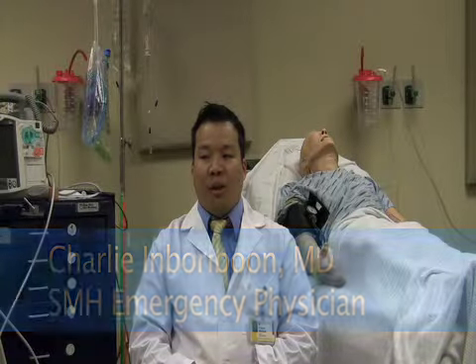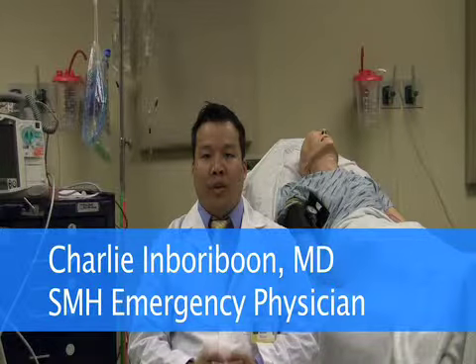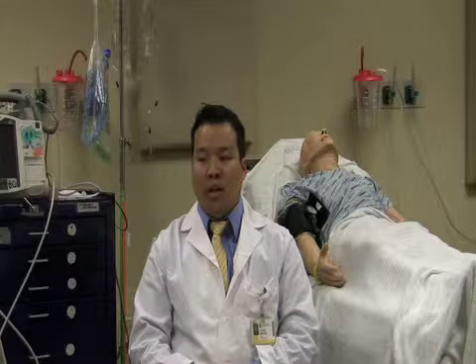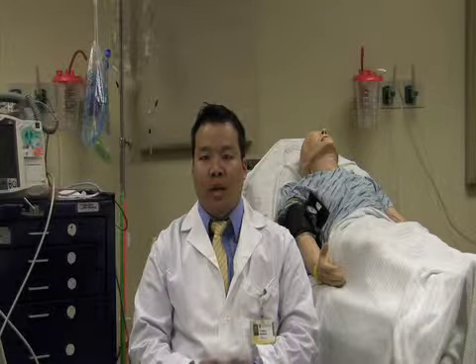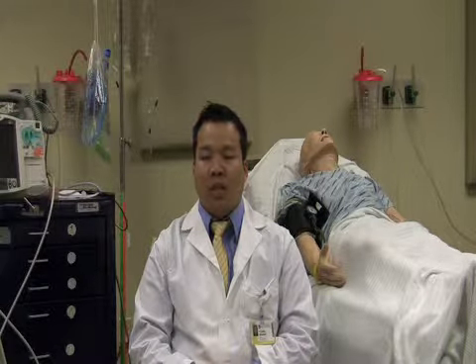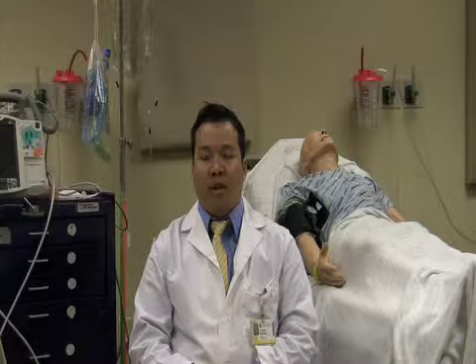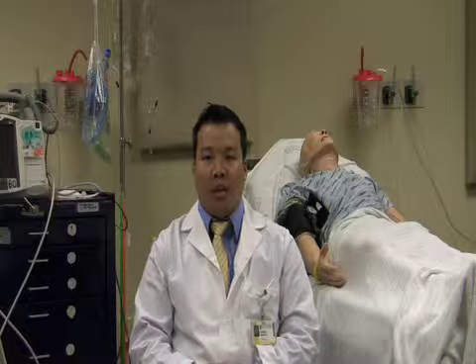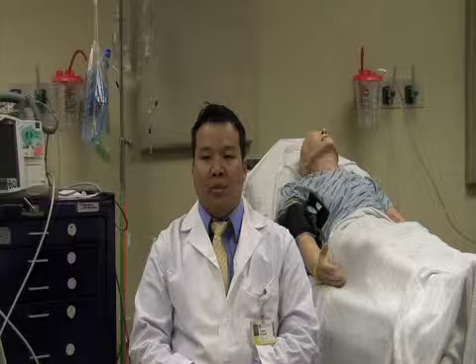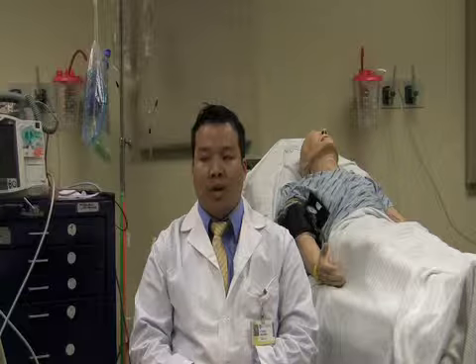The common pacemaker malfunctions include failure to output, this being a failure for there to actually be delivery of the pacemaker potential, failure to sense, which may be an inability for the pacemaker to actually sense the intrinsic potential of the heart, pacemaker-mediated tachycardia, which may be a malfunction of what the pacemaker is actually sensing, as well as runaway pacemaker.